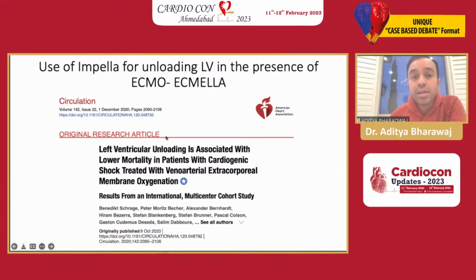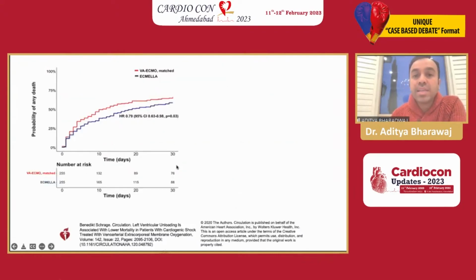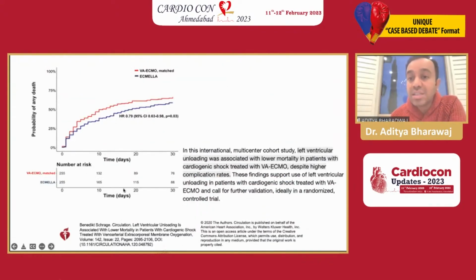And this is an important point to make, because even if you go with an ECMO, like I said, ECMO increases afterload, and it actually is detrimental to the pathophysiology of the heart in patients with cardiogenic shock. So Impella should be considered for unloading even in the presence of ECMO, the so-called ECMELLA or ECPELLA, and there is actually data to suggest this as well.